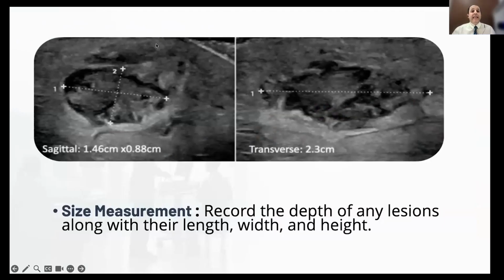When you find a lesion, you need to measure what you find. We need to record the depth of the lesion, and also the length, the width, and the height. We always need to record what we find, just for medico-legal issues. So we need to record our images and measurements in the file. For the measurement, you need to record the depth, length, width, and height.